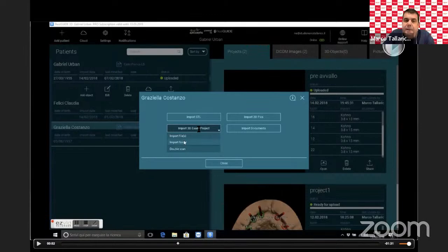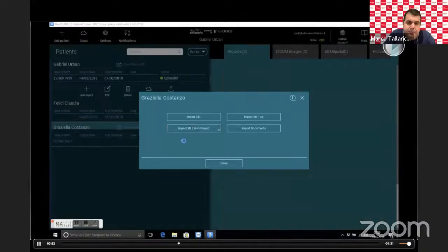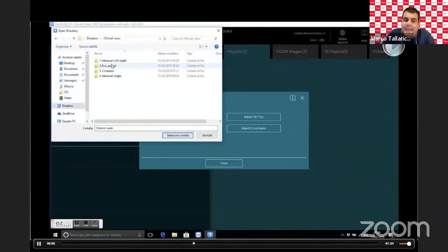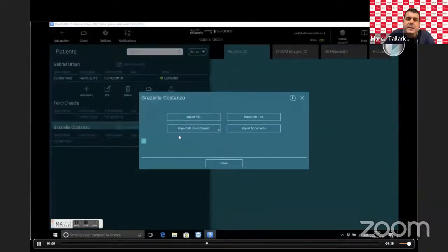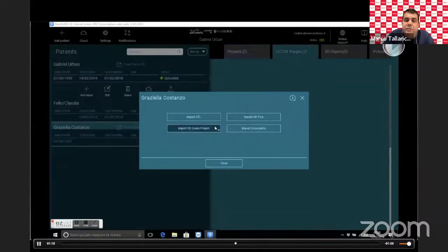The first step is to import the DICOM file. If you have a double scan technique, you need to select 'double scan'. If you have DICOM data and STL data, you simply import the DICOM folder. It is very important to organize your data: put DICOM and STL in one folder named after the patient, with subfolders for DICOM and STL, and name the files correctly — because when you import you cannot see a preview of the file.